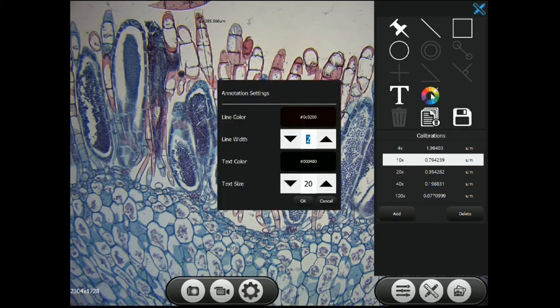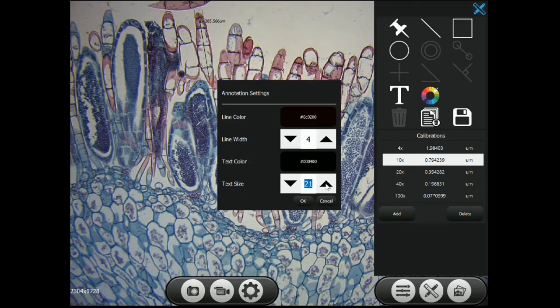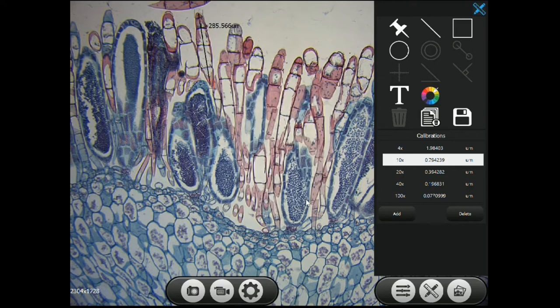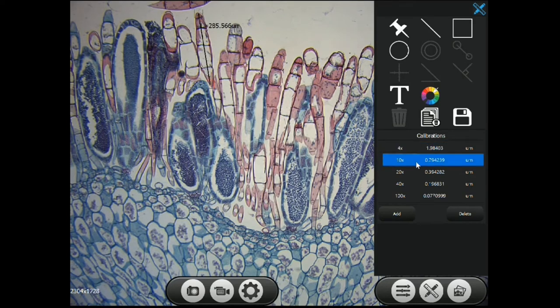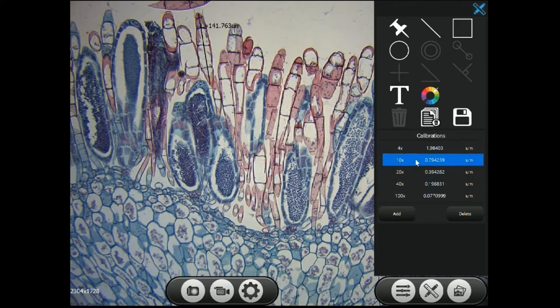You can change the line width, the font size. To display the length in units of micrometers, click on the calibrated value here that matches your current objective.